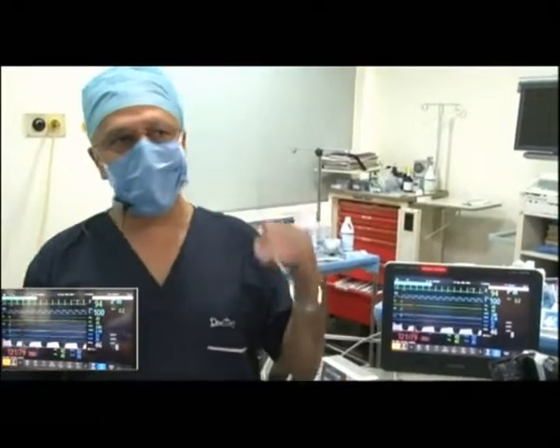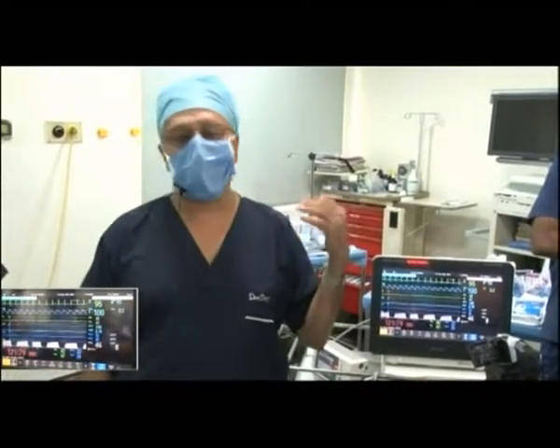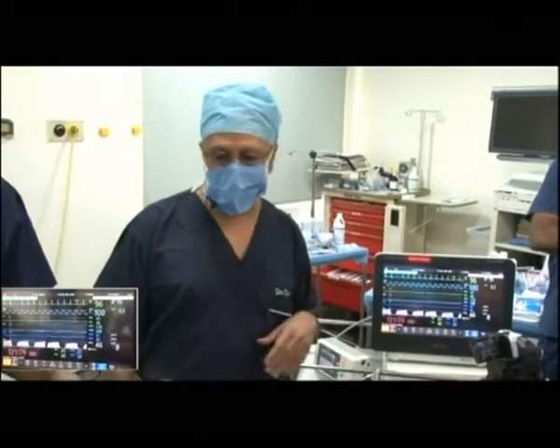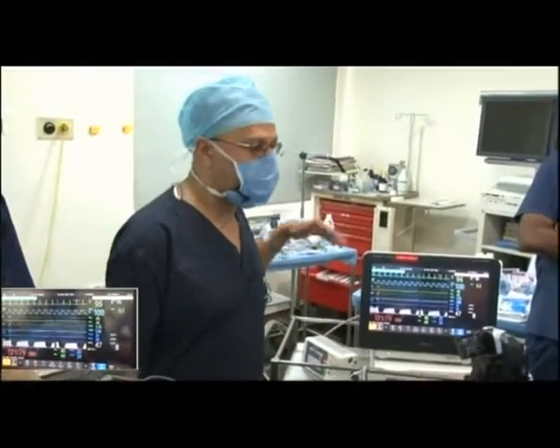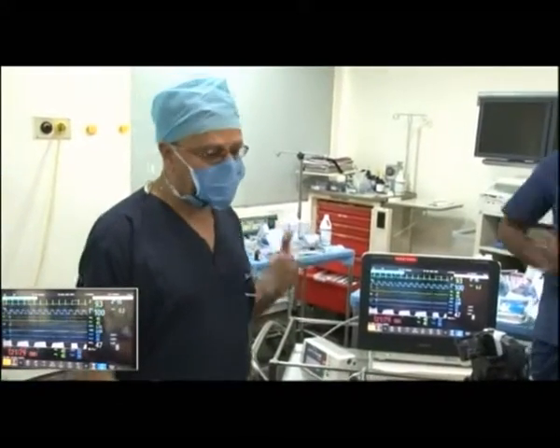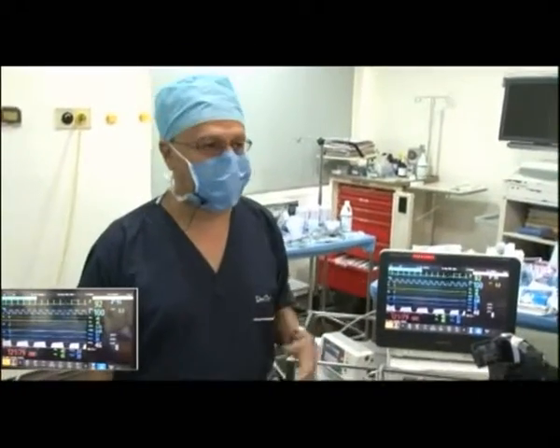And for every decade increase in age, there's a 7% drop in the MAC requirement. So yes, ideally, before we get started, if I had an older patient, I would put the age of the patient in the monitor so it will automatically adjust the MAC value for me. But if your monitor doesn't do that, it is 7% reduction in MAC value per decade.